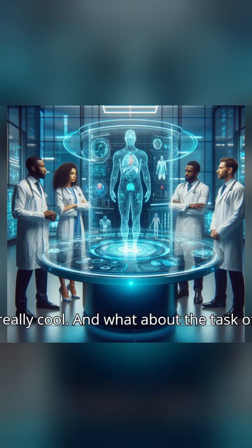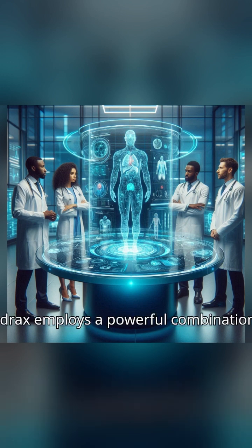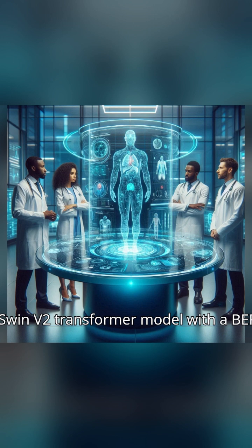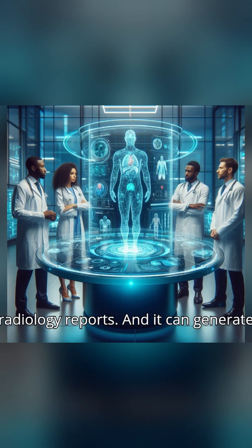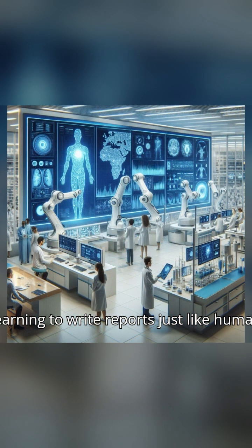That's really cool. And what about the task of actually generating those detailed radiology reports? For report generation, MedRAX employs a powerful combination of a SwinV2 transformer model with a BERT decoder. This model is trained on a massive data set of expert-written radiology reports, and it can generate really comprehensive summaries of the findings in the CXR. Wow, so it's learning to write reports just like a human radiologist.